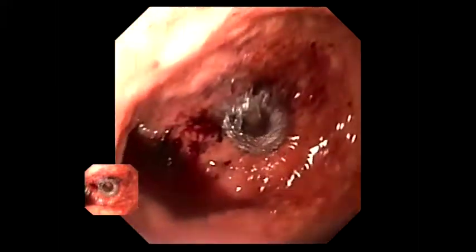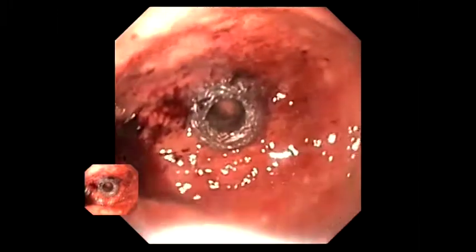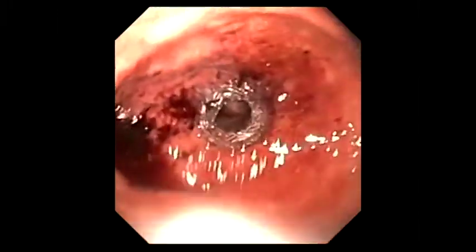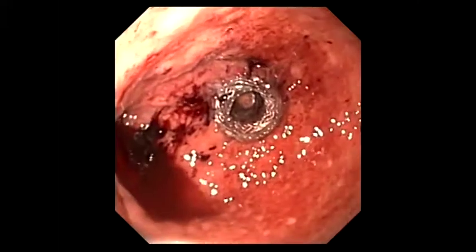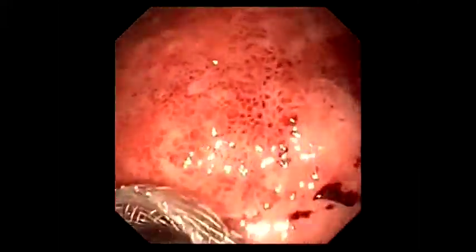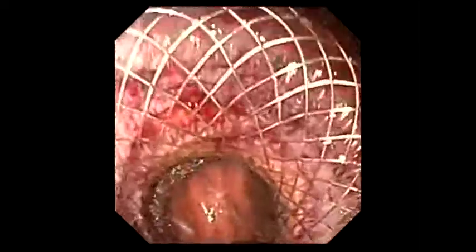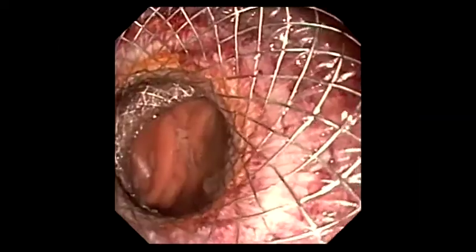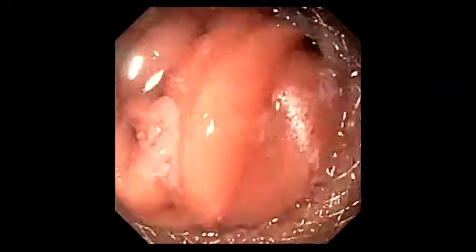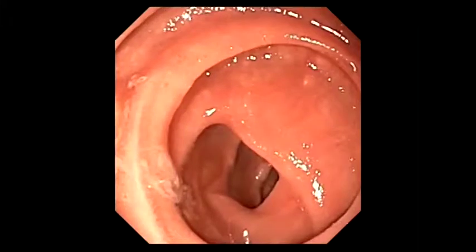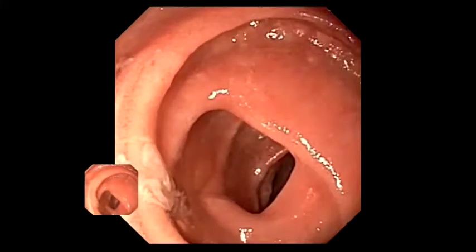Subsequent checking of the findings using the gastroscope shows the proximal stent bulb correctly placed in the stomach. Once the stent has been passed with the gastroscope, the correct positioning of the distal end of the stent can also be verified. The small bowel mucosa on the distal side of the stent is easily recognizable.